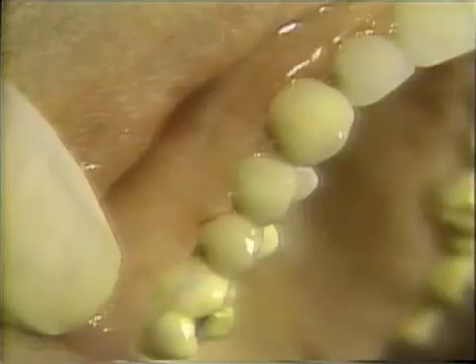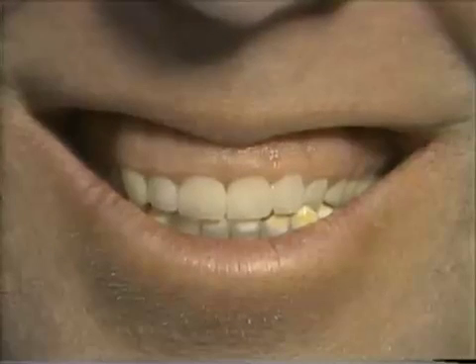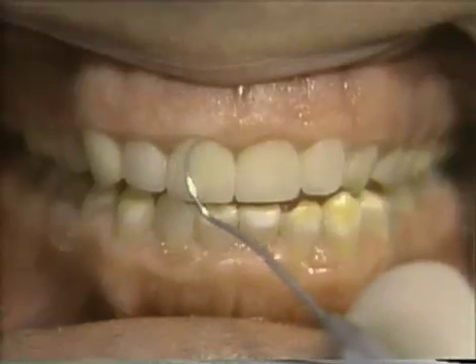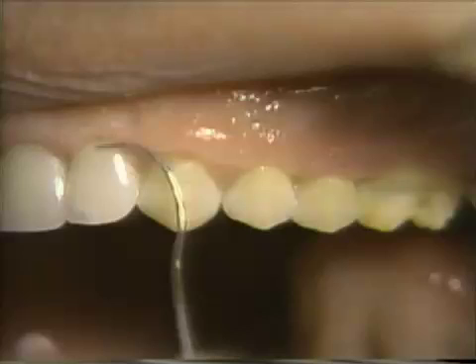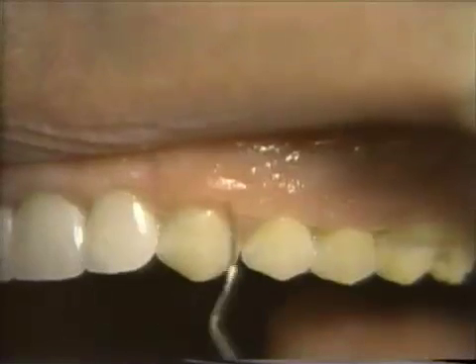Here we see the polished porcelain blending nicely with the soft tissue, fitting harmoniously in with the other teeth. The tissue reaction on the teeth is very good. The patient is taking dilantin, so we have a little bit of gingival response to that. However, the margin is brought under the soft tissue quite a ways so that the graying doesn't show. And you can see also the laminates and the tissue response here on the side, and how it nicely hides the purpling. Now with good oral hygiene and some tender loving care on these porcelain laminates, they should last the patient for a good many years.